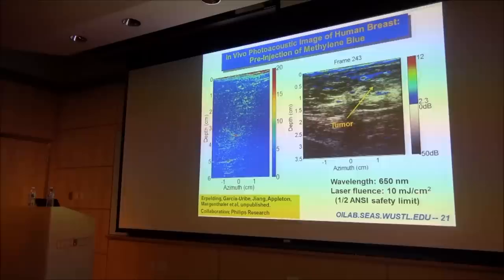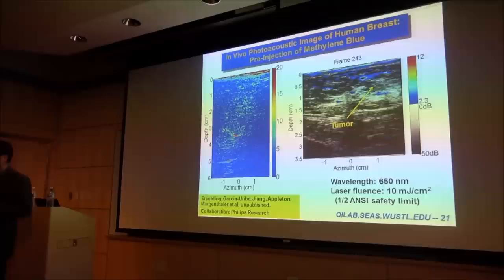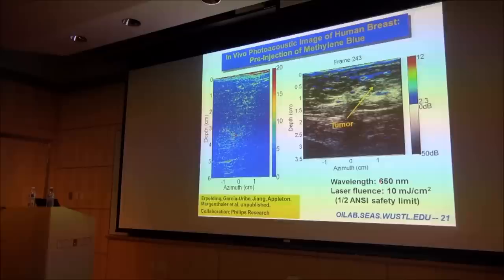Notice the laser fluence we use. We're using one half of the ANSI safety limit, so there's really room for improvement in that regard. If you use stronger light delivery, you'll get a stronger signal as well, potentially deeper penetration or better SNR. We're using a red wavelength to penetrate deep.